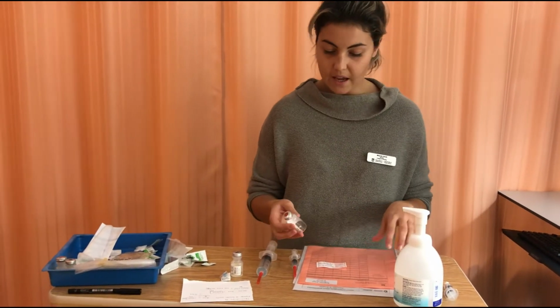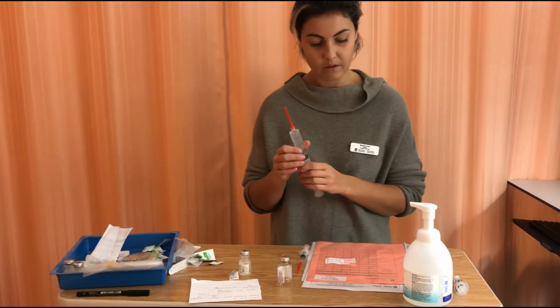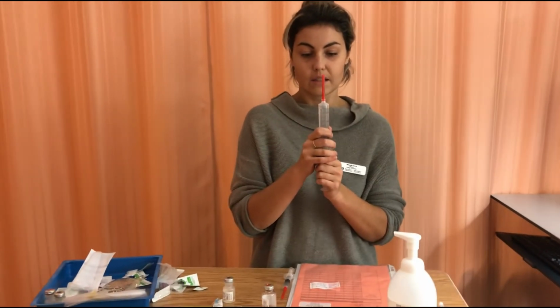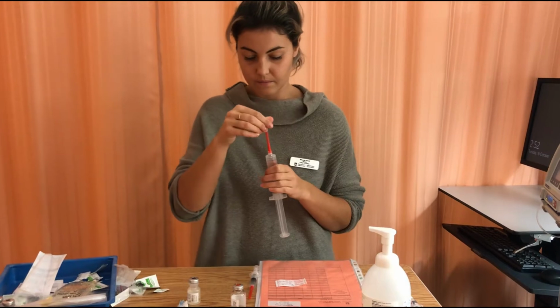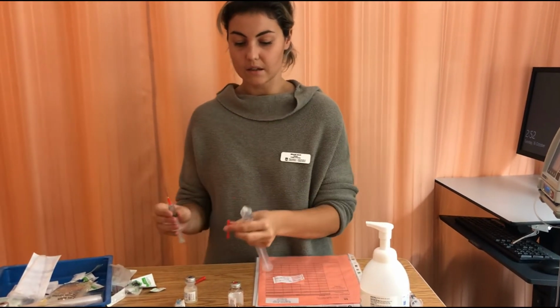For IV, and the time is right now. Now I will place the remaining syringe in here, removing the cap, maintaining sterility.